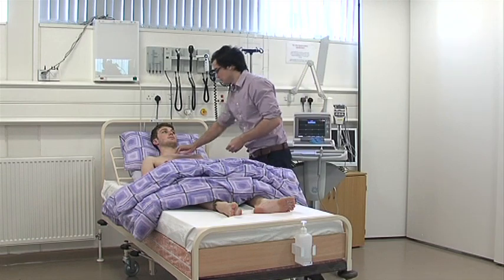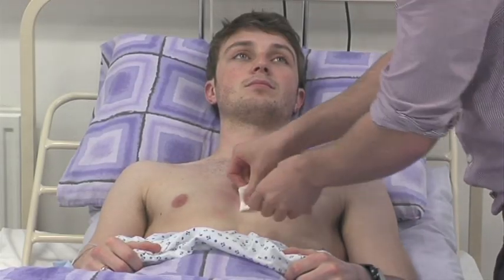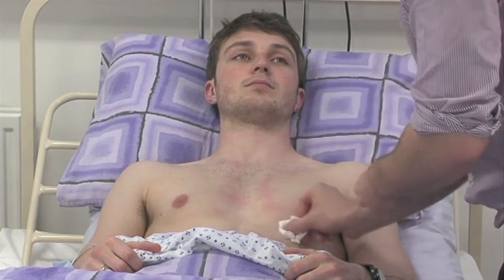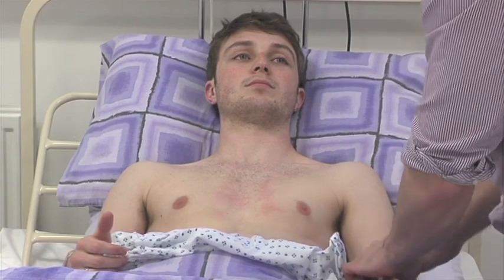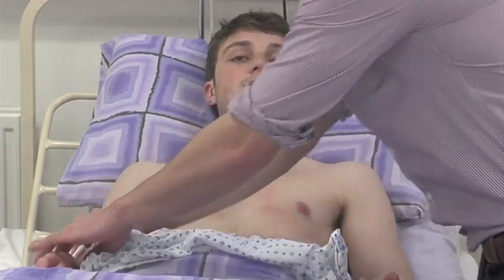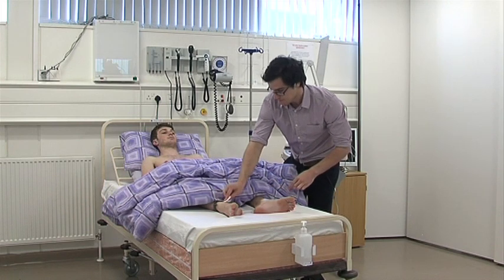If necessary, prepare the skin for placement of the electrodes by removing any excess hair and cleansing with an alcohol wipe. Areas should be clean and dry, which reduces impedance and improves the quality of the ECG. To achieve accurate results, the patient should be relaxed and comfortable.